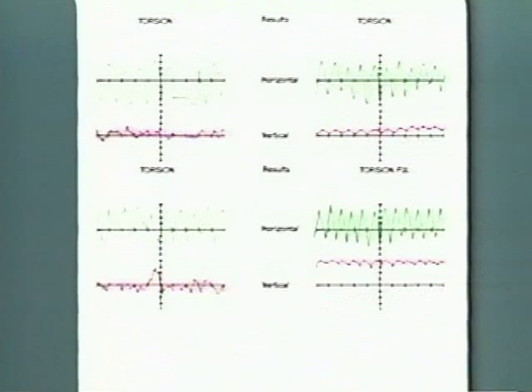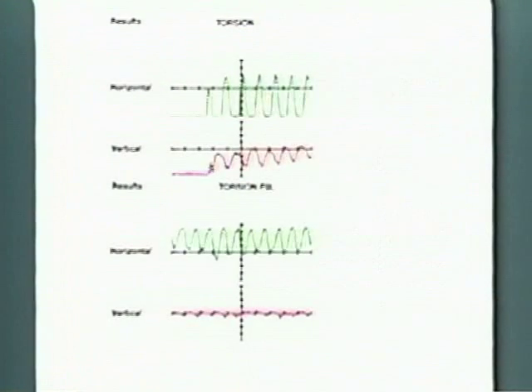In the final three examples, there is no decrease whatsoever in nystagmus, or in fact, an increase in the degree of nystagmus, again consistent with central vestibulopathy. These examples demonstrate the absolute need for the operator of the testing equipment to be very attentive to the degree of nystagmus, which is seen through the infrared goggles on the television screen.